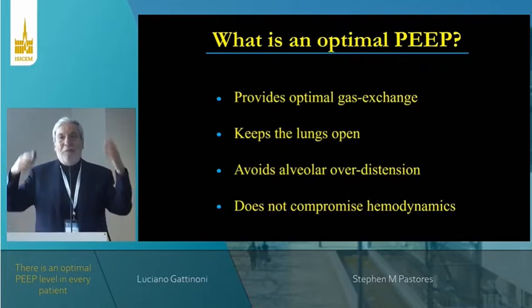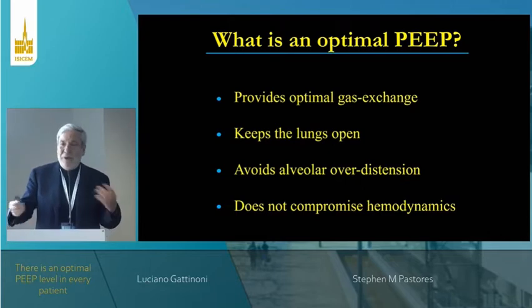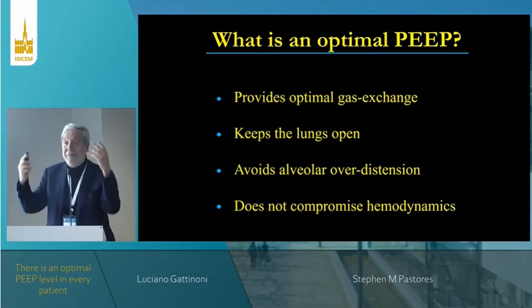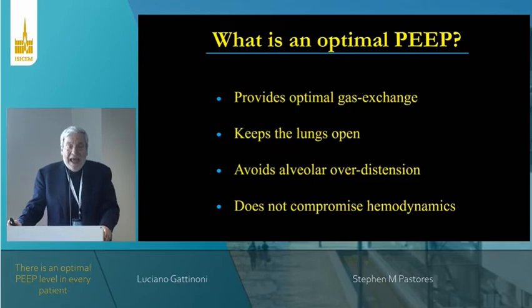So, what is the optimal PEEP? We love the word optimal, best, beautiful PEEP. Great. It should provide optimal gas exchange. What is optimal gas exchange? It must keep the lung open.